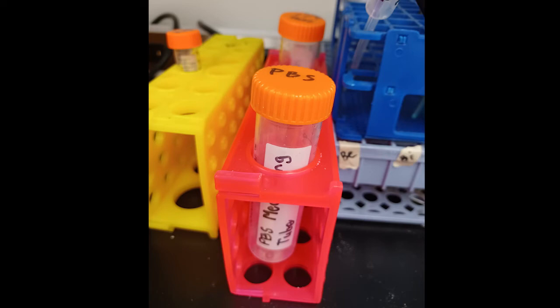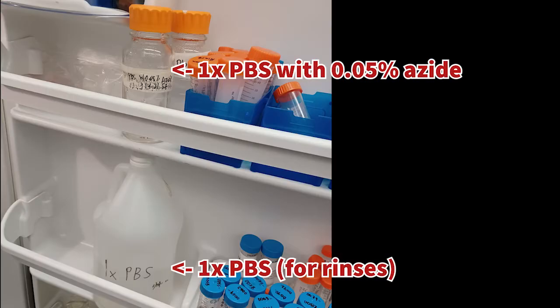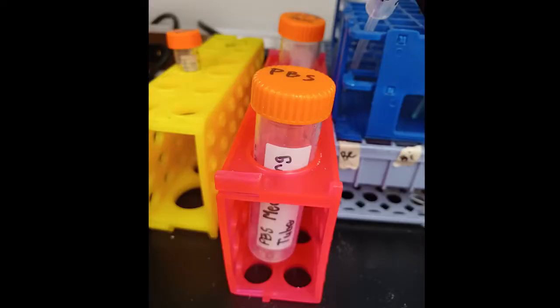To prep for rinsing, we'll want to move some 1x PBS solution from that large jug from the fridge into a smaller container. In the pink holster shown here, there should be a PBS measuring tube. Fill this tube up with that 1x PBS solution from the jug, being careful not to spill.